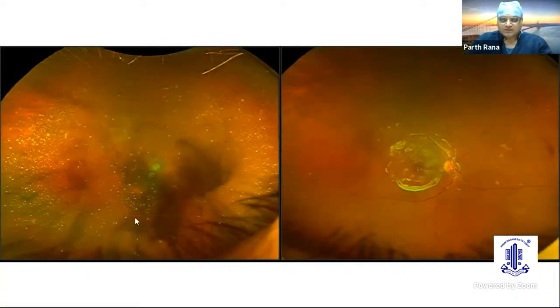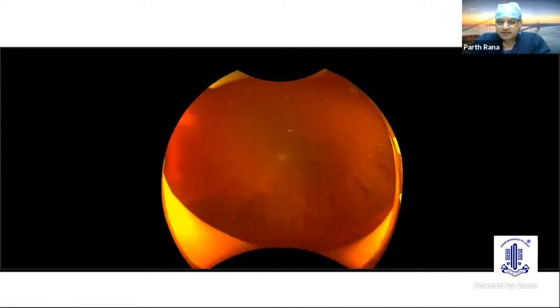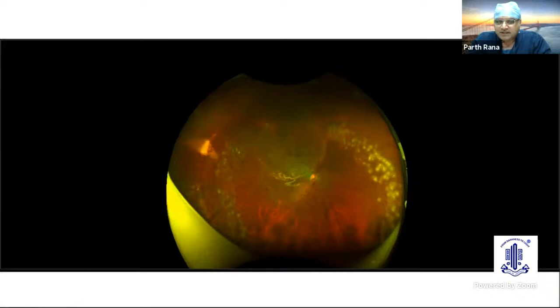I'll show one more case. This was the pre-op hemorrhage, and we operated the case, and the patient had the picture like this. So this is one more case I'd like to show. This patient came to us just a few days ago. When we did Optos, I could see just a faint disc here. In my indirect ophthalmoscopy, I was not able to see anything in the fundus, but we saw a faint disc here. Then we operated the case.